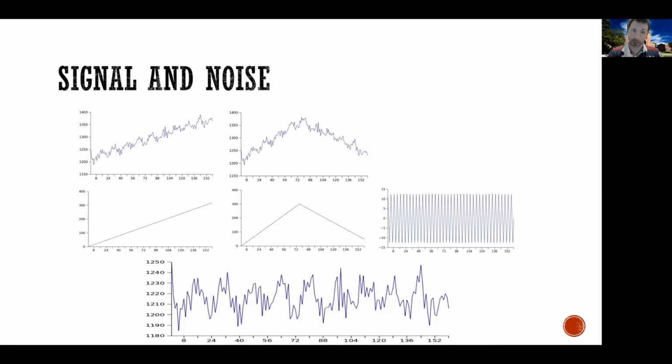Stuff that changes at that periodicity, I know exactly what it is. It's my task. Anything that changes slower than that, I don't know. It's noise. Anything that changes faster than that, I don't know. It's noise. I can't explain it. All right? So if you took this signal and added this high frequency noise, it would look like this. See, now there's much more wiggling inside of my time series. And here again, the signal to noise ratio is not very favorable.